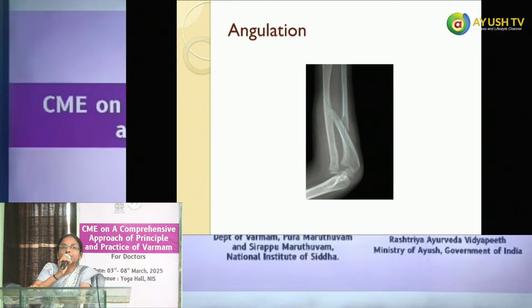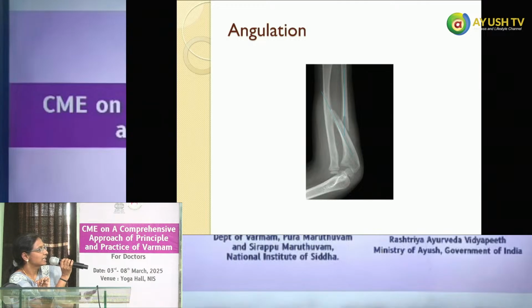This is called as angulation. Again this is X-ray of the lateral view of elbow joint. Radius ulna-வும் depth காமிச்சிருக்கு. ulna-ல there is a fracture. See ulna fracture-ல மேல இருக்கிற segment-ஓட long axis cross-ஆ இருக்கு, distal segment-ஓட long axis straight-ஆ இருக்கு. So the axis of both the fractured segments make an angle. So that is called as angulated fracture. So these are the terminologies which are generally used in the imaging modality report interpret பண்ணும்போது these will be the terminologies that are commonly used: alignment, displacement, angulation.